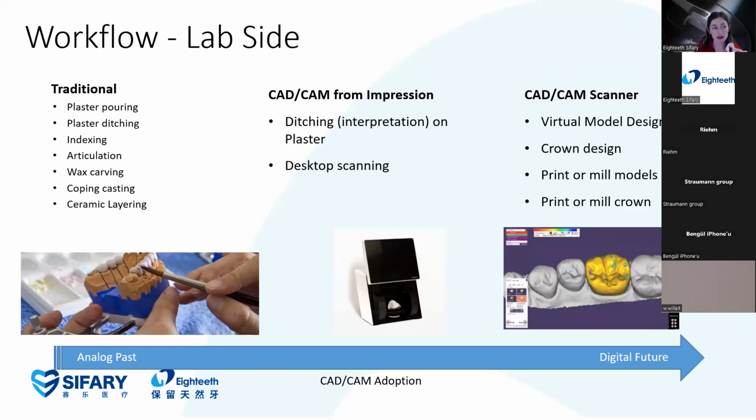In the traditional workflow, they have to keep going through the whole flow, and after that they start working from the model. But if the doctor uses an intraoral scanner, there is no need for all of that. So it saves time. That's why doctors start to digitalize.